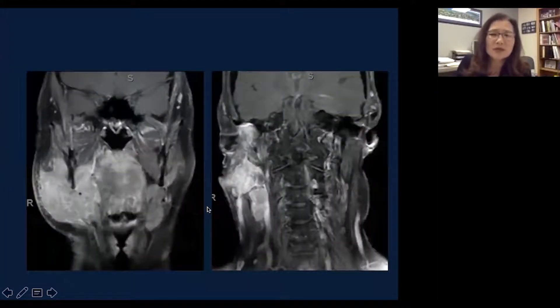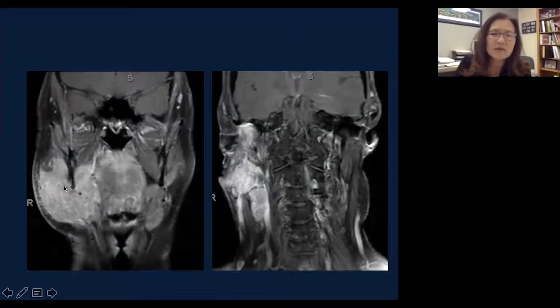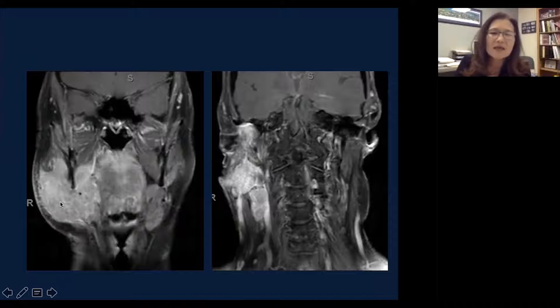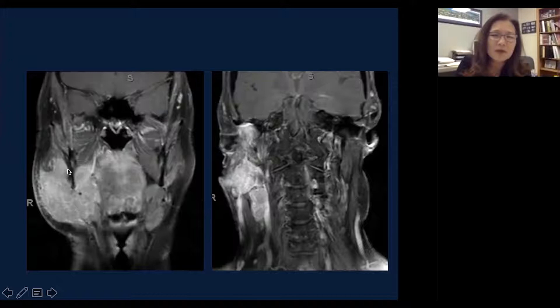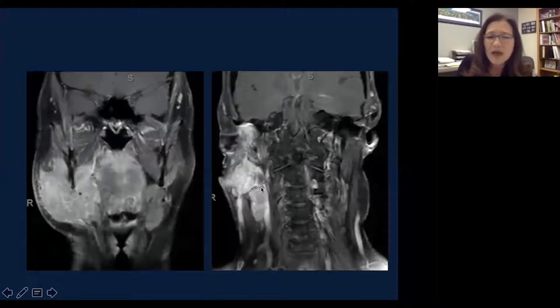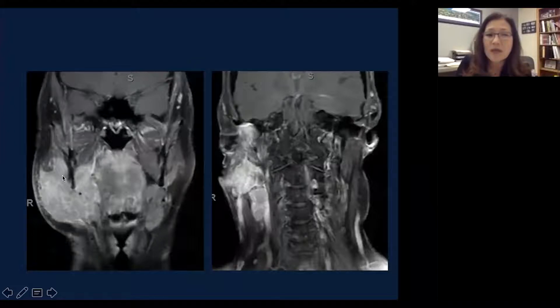From the coronal view, you can clearly see the mass invading the masseter muscle as well as the medial pterygoid muscle. Notice the normal medial pterygoid muscle on the contralateral side. It extends to involve the submandibular space, and the submandibular gland is no longer seen on the right side. The bone appears much thinner or eroded compared to the contralateral side. Notice the abnormal cervical lymph node — this is nodal metastasis from the parotid gland mucoepidermoid carcinoma.